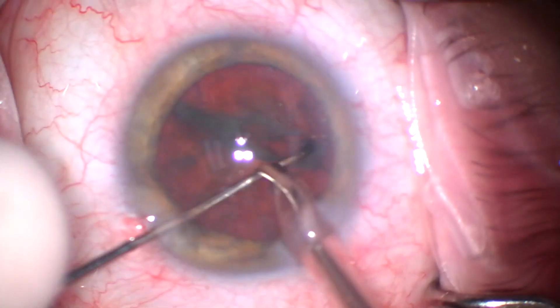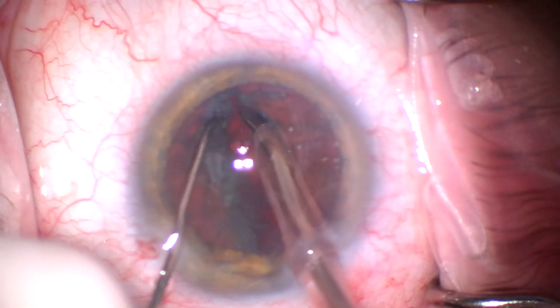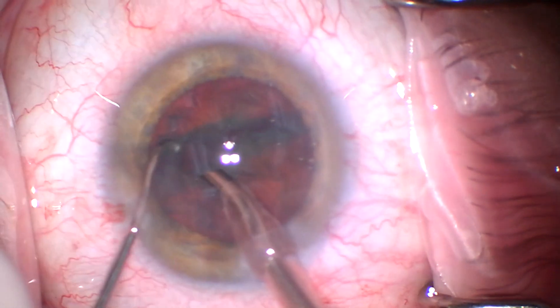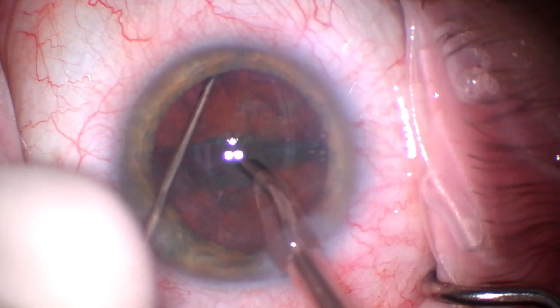I apologize I don't have my fluidics display — that is a setting I know I can turn on on my Alcon microscope but I keep forgetting to do it. I'll try to do that.